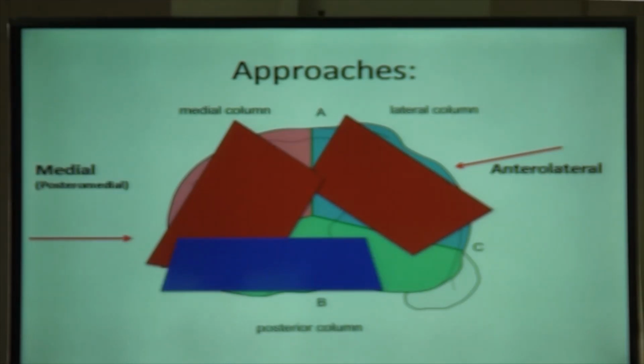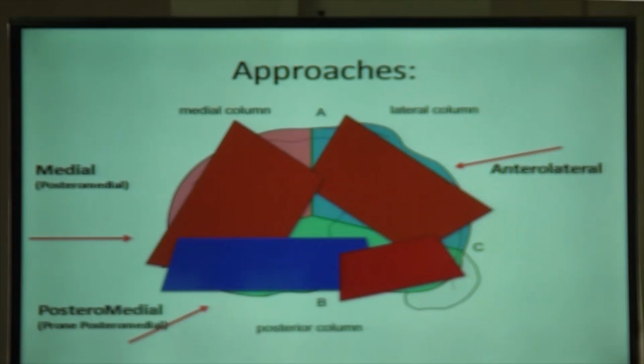And then we're gonna flip and do the post-medial approach, and we're gonna get access to all the posteromedial surface up to the head of the fibula. And then we're gonna do the direct posterolateral approach. This is the sequence we're gonna do now, okay?